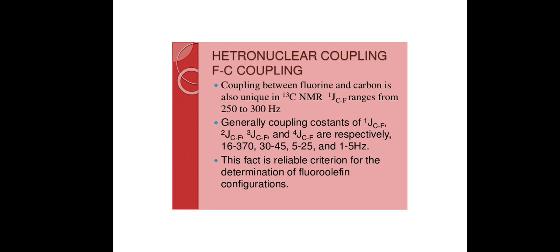F19 magnetic resonance imaging, that is MRI, is a viable alternative to proton MRI. The sensitivity issues can be overcome by using soft nanoparticles. Applications include pH, temperature, enzyme, metal ion and redox responsive contrast agents. They can also be used for long-term cell labeling.